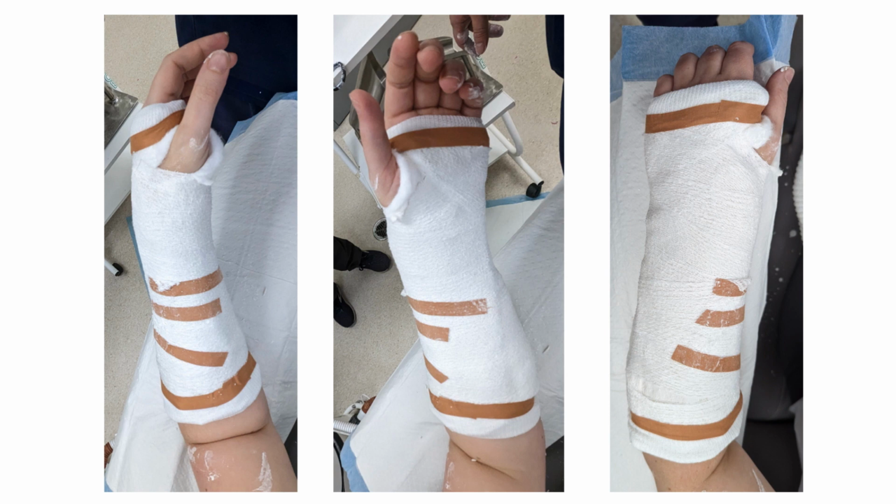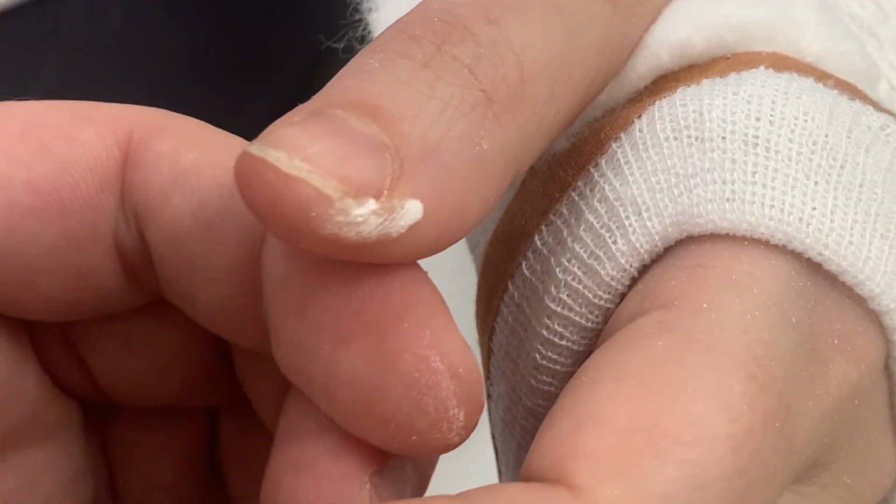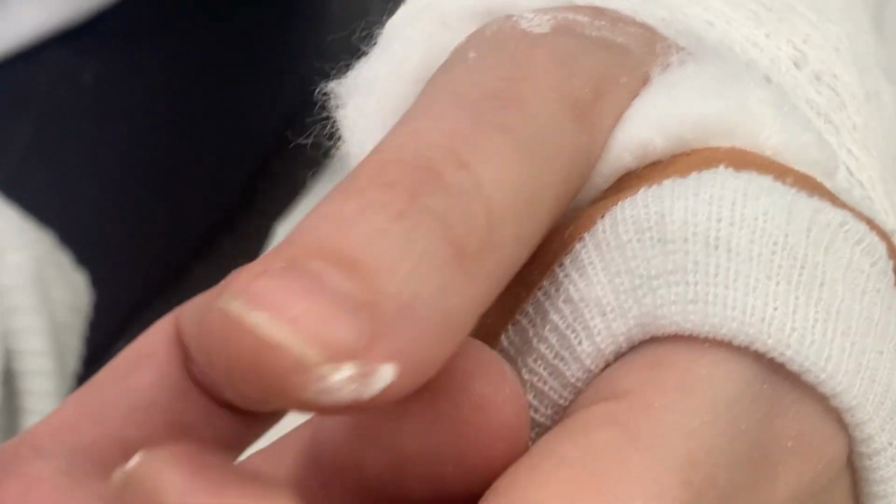It is now time to inspect the cast. It should be warm and hard as the plaster has now begun to set. Ensure the cast is in a good position for the patient, checking the patient's comfort and making sure there is good movement of the joints above and below the cast, whilst complete immobilization of the joint in question, in this case the wrist. Next, it is important to ensure there is good capillary refill and sensation of the fingers.